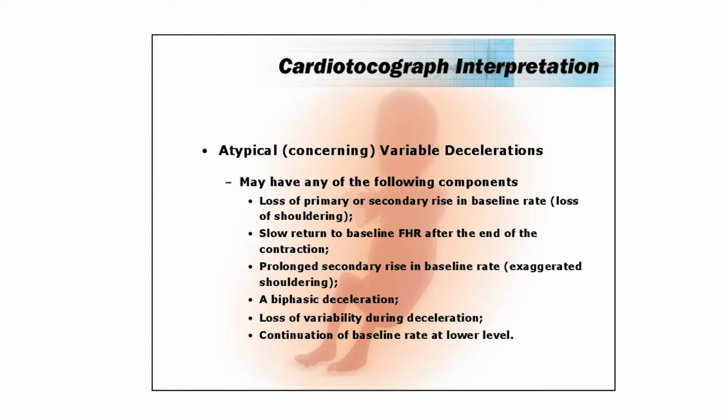Why is that much more unlikely to happen? The normal fetal physiological response to hypoxemia is to do what with the heart rate? Increase it, isn't it? Not decrease it. A decreasing fetal heart rate is very concerning, particularly if it's associated with a chronic abnormal fetal heart rate pattern, because that might be suggestive a baby has lost any compensatory mechanisms to deal with whatever insult it's being faced with.